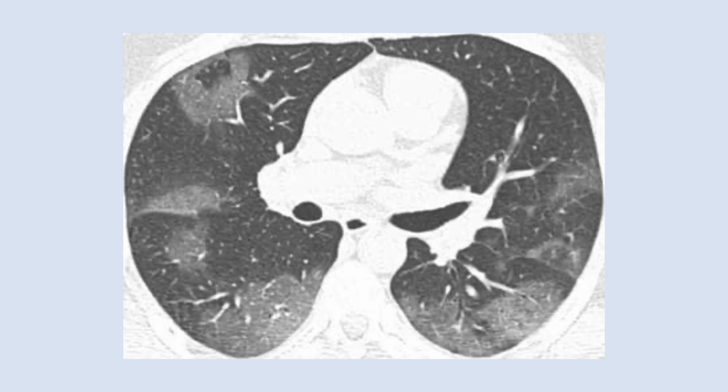Again, here are patchy ground glass opacities. This was something that showed up in early COVID, and so people built a lot of machine learning algorithms right at the beginning that were going to, quote, diagnose COVID because they were finding the ground glass opacities. Well, these ground glass opacities existed way before COVID ever showed up, and they have a big, wide distribution of diseases.